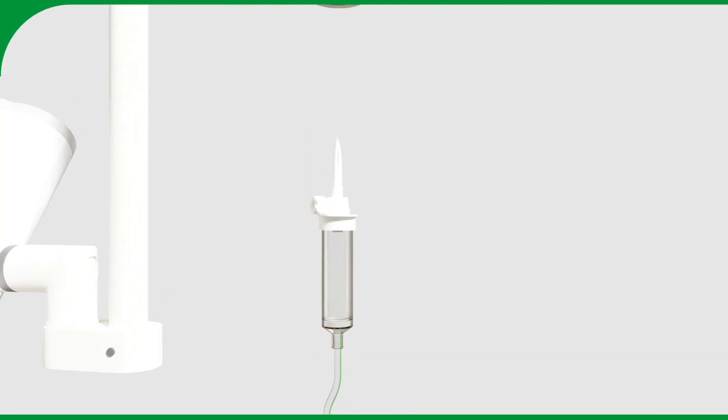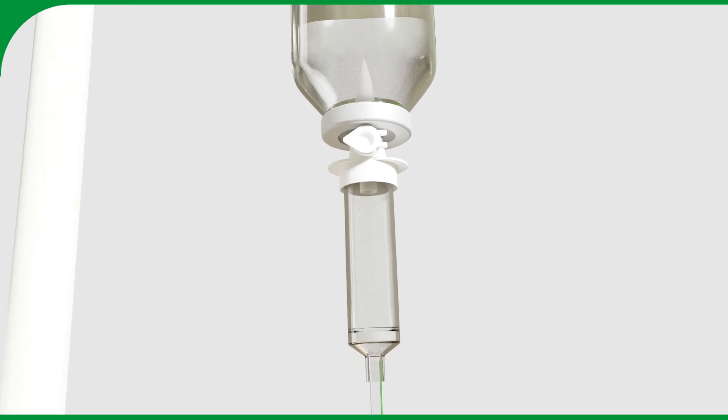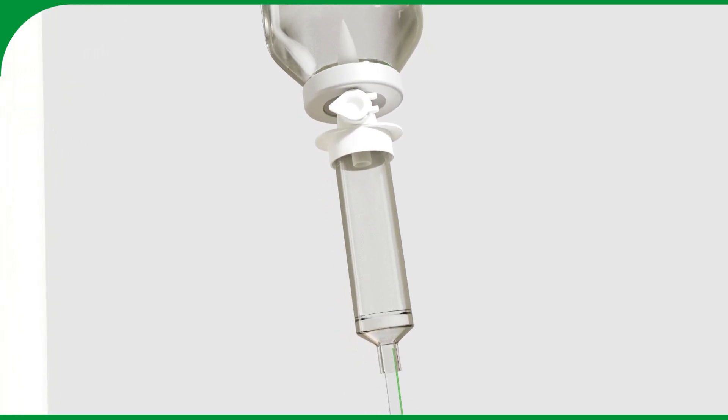On the green-marked side, use the spike to connect to the contrast media bottle. Open the air inlet and squeeze the drip chamber.